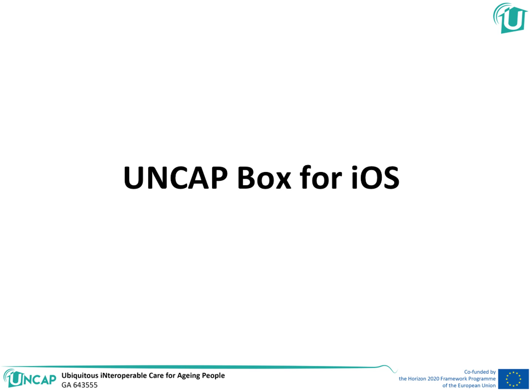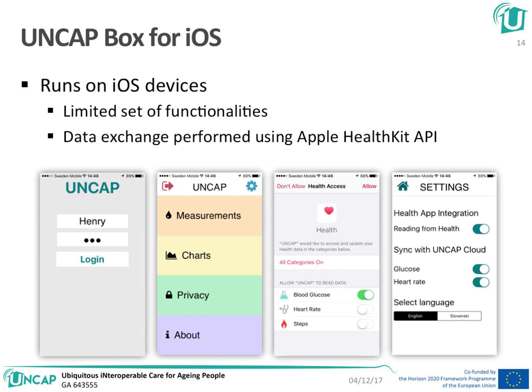Now there's also an Uncap Box version for iOS. But since iOS has many more limitations on how to perform cross-application communication, we've only supported a limited set of functionalities. For data exchange, we've used the Apple HealthKit API, and here you can see that once the Uncap application is authorized to read data from HealthKit, it can in fact fetch data from most HealthKit compatible apps.